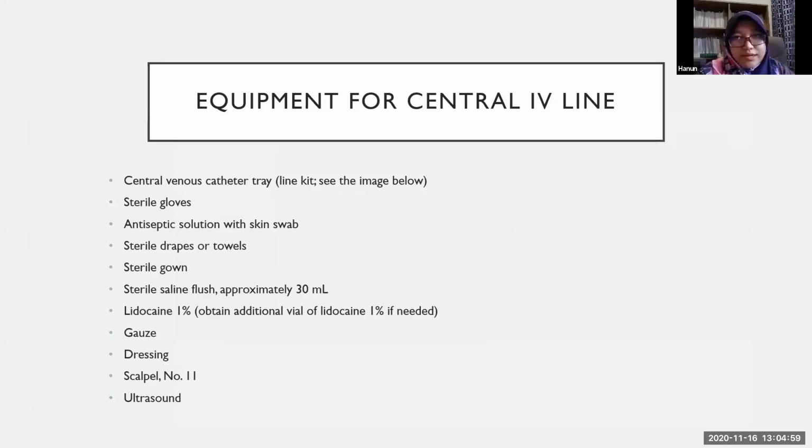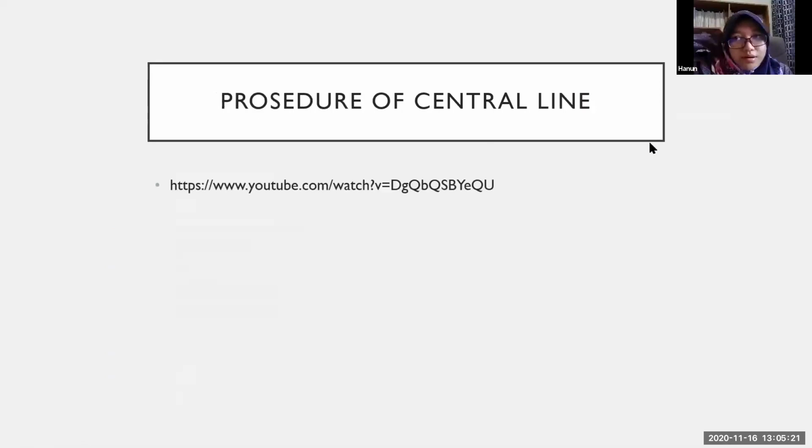Okay, next. Okay, this is the equipment for central line. So all the sterile gloves, the sterile gowns. Lidocaine is actually a medication. So there's also the cap and also ultrasound. Okay, Lokman next. Actually, this depends on the video.